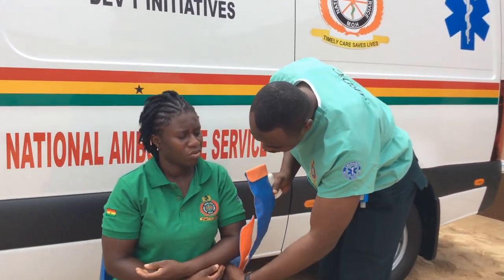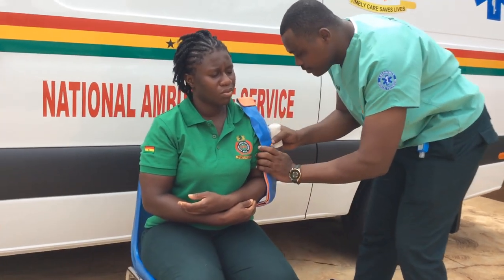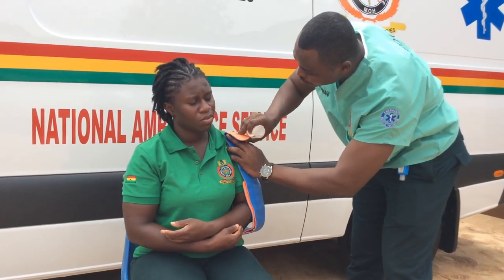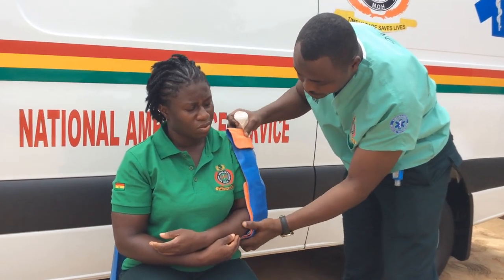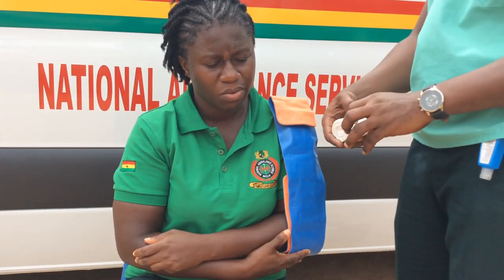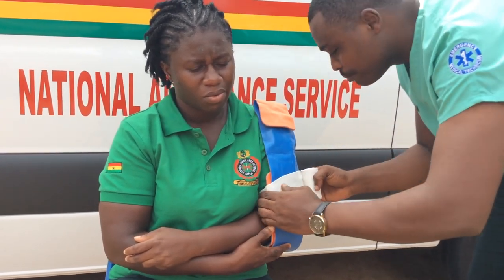So first you place it there. You realize you have to break it down this way. Then you support it, and at this point we bandage — so you start bandaging.